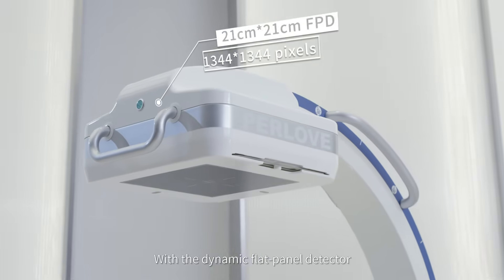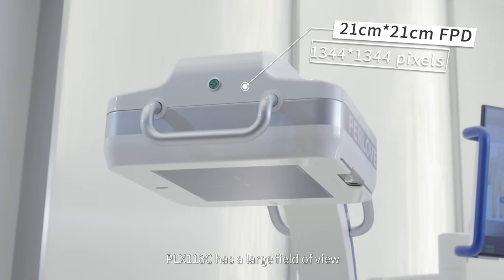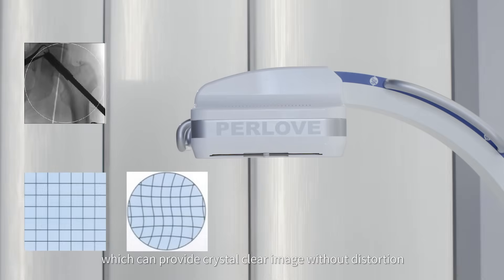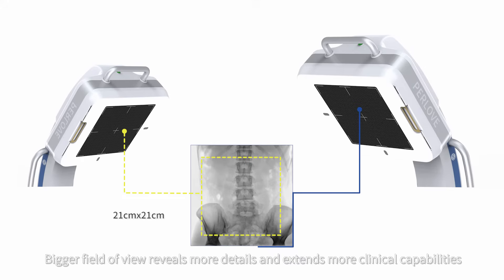With a dynamic flat panel detector, the PLX118C has a large field of view, providing crystal clear images without distortion. An optional upgraded flat panel version is also available, with a bigger field of view that reveals more details and extends more clinical capabilities.